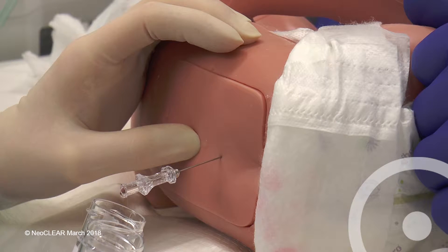If CSF is not flowing, consider rotating the needle to face the bevel towards the head, massaging the fontanelle, or slowly advancing or withdrawing the needle depending upon the position.